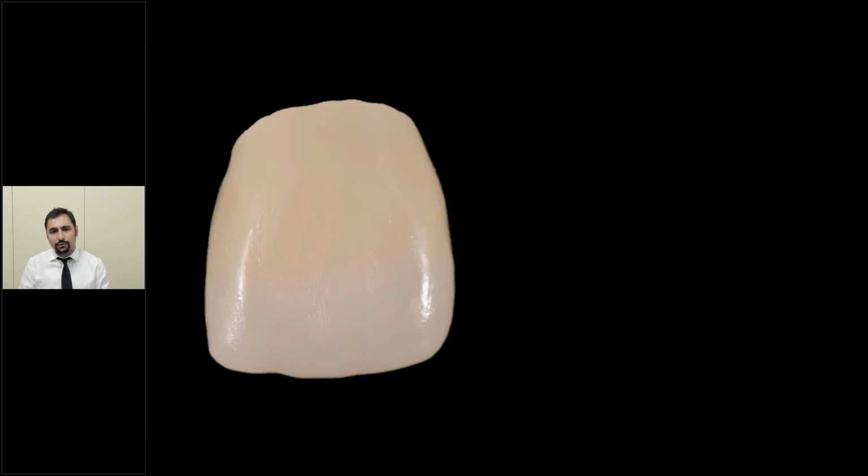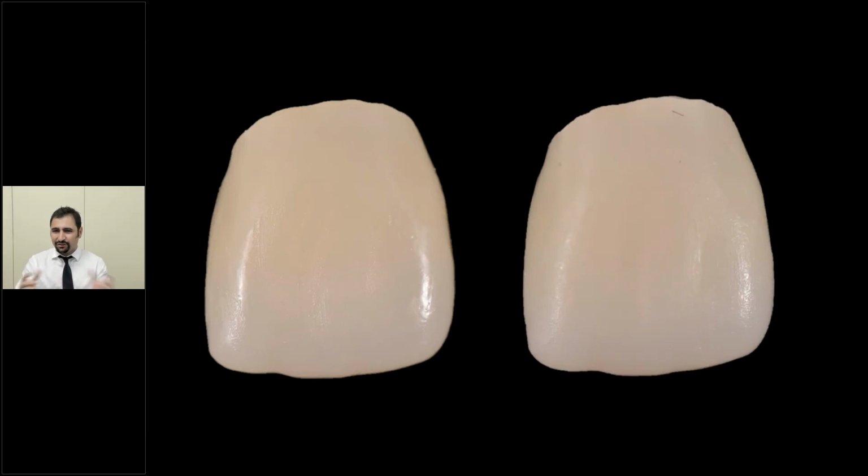This is a Zirlux crown that was sintered by Master Edwin at LSU School of Dentistry. He made two similar Zirlux transition crowns. This one, he sintered 10 degrees less than the one on the right side. Depending on the quality of your monitor, you can find out that the one on the right has higher value, it's brighter, and it's exactly the same zirconia. The only thing changed is the sintering temperature, which only changed by 10 degrees.